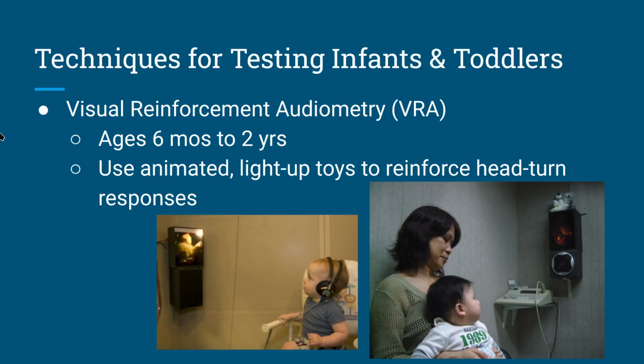They might use bubbles to help center the child on them until the sound goes off, and then they're conditioned. The sound goes off, they turn the head toward the reinforcer, and the head turn signals to the tester that you've got a valid response.